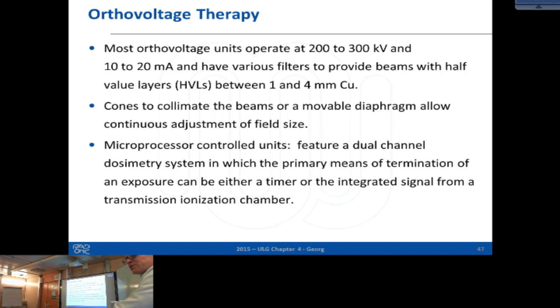Yeah, if you open the patient, and usually when intraoperative radiotherapy is performed, that is only done in dedicated rooms that also have a certain class in terms of this classification of operation theaters. For example, in our department, we have 2 operation theaters, but we are not allowed to perform intraoperative radiotherapy there because the classification in terms of sterilization and so on is not high enough. I don't know all the details about these classifications, but I just know that there are differences.